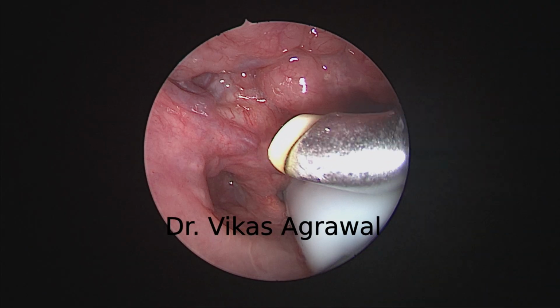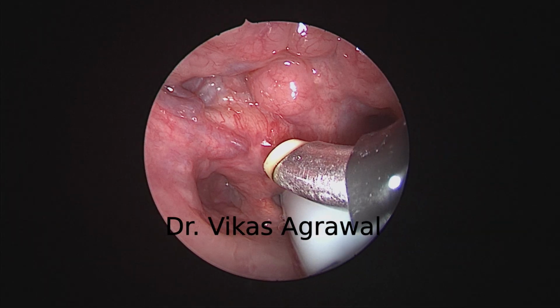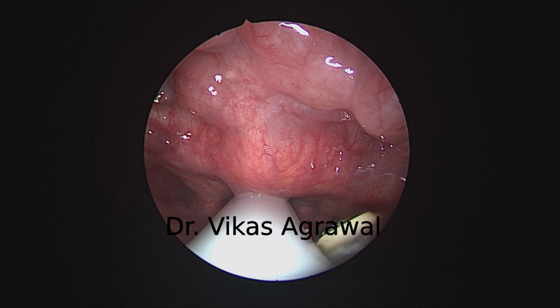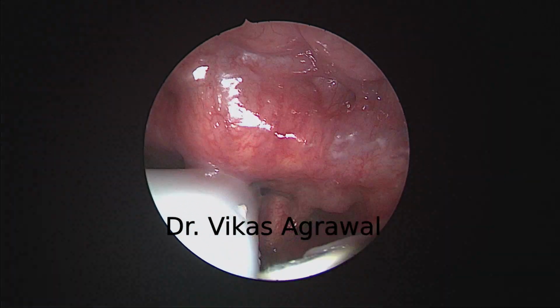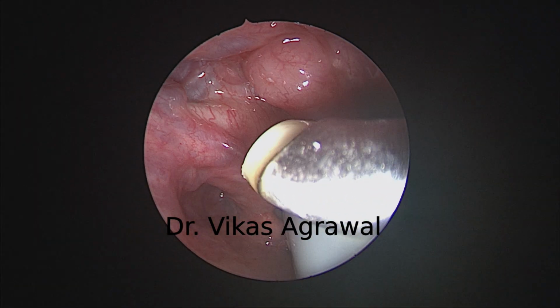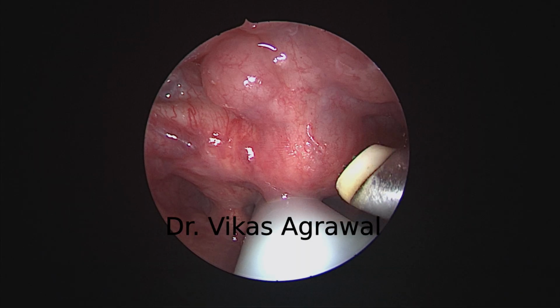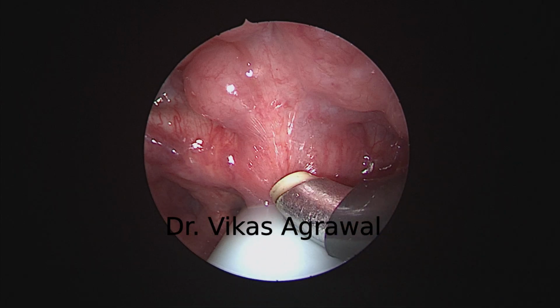And you can see very nicely the vessel in the glossoepiglottic ligament, the lateral glossoepiglottic ligament containing the vessels. So if you operate in these lateral areas, you are bound to get brisk bleeding. In the median glossoepiglottic ligament area, which is this area, you generally do not have those prominent vessels.